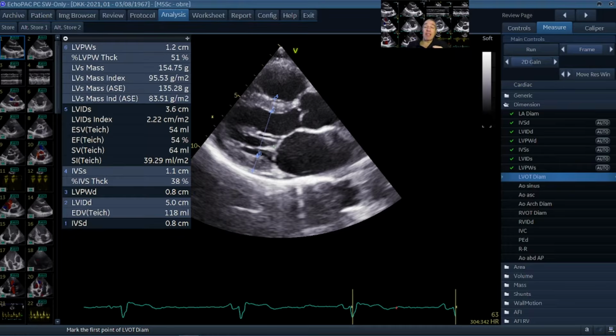Now these are our standard measurements. This is now end systole, and if you want to do further calculations later, for example for the aortic valve, you might in some patients, not in everyone, be interested in the diameter of the left ventricular outflow tract, which is here below the aortic valve. And this again is measured at its largest diameter, which is typically end systole, in an anterior posterior direction.